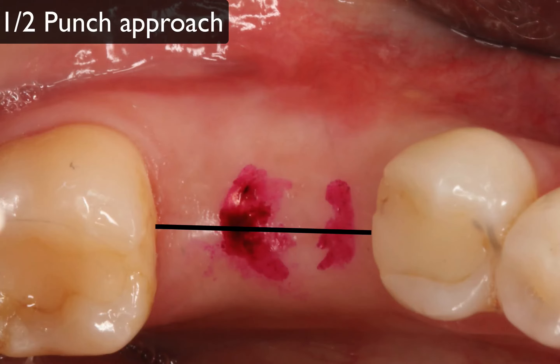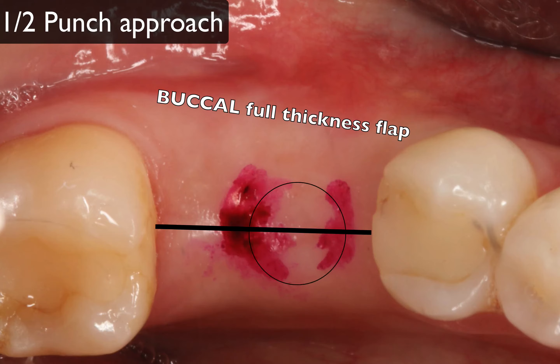I'm going to make a mid-crestal incision, reflect a full thickness flap on the buccal, but leave the lingual tissue attached and then use my punch. So technically I'm only punching the lingual flap, and that will preserve more attached keratinized tissue on the buccal aspect of the implant.